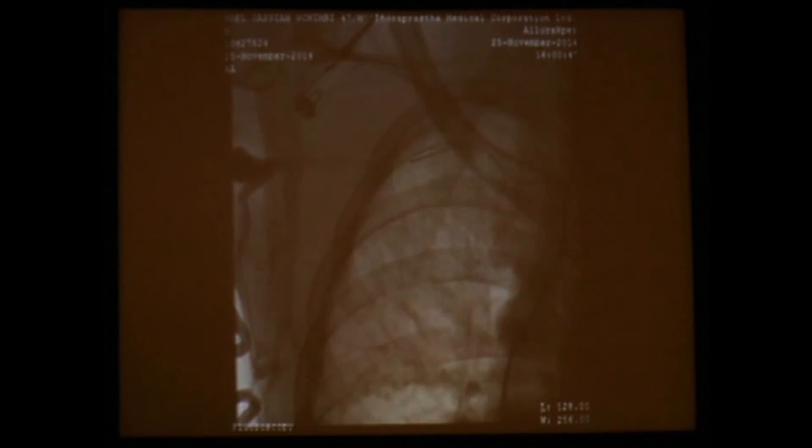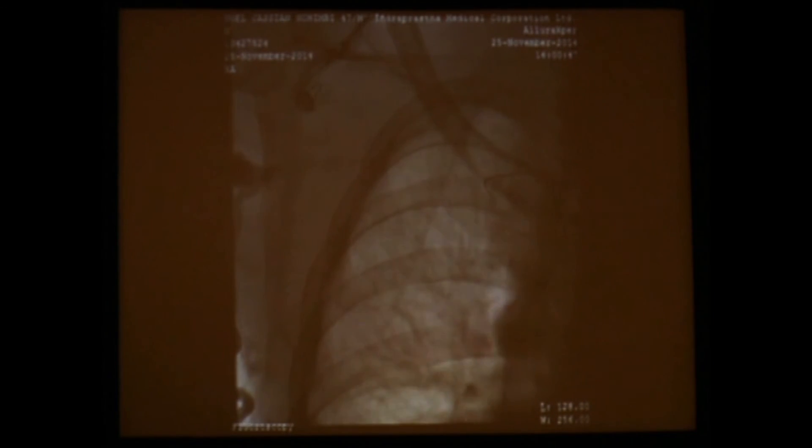We tried to pass the guidewire through the right subclavian vein. We could see some contrast flowing in that direction, but since the stenosis was quite stiff and it was a total complete occlusion, the guidewire couldn't be crossed.